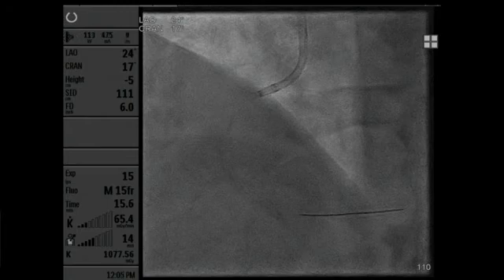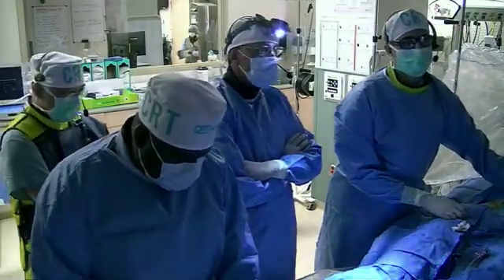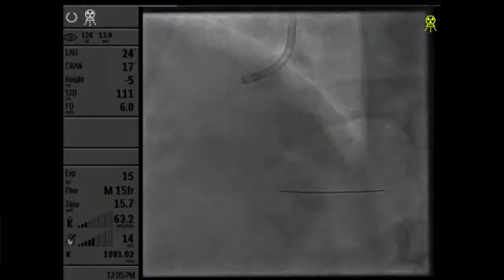Yeah, so right now, we need to learn that together. We have now all three modalities. I agree that from a safety perspective, the best safety profile you will find is in IVL. Efficacy-wise, we'll have to see which one. And it's also a question of comfort with the technology.